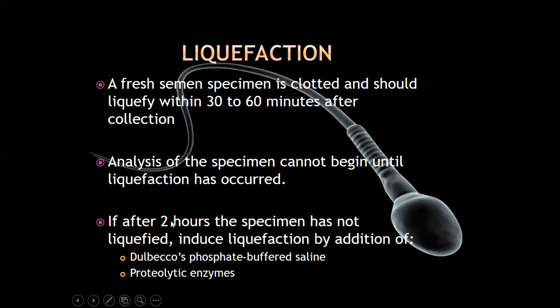Now, if after 2 hours the specimen has not liquefied, you need to induce liquefaction using Dulbecco's phosphate buffered saline and proteolytic enzymes such as bromelain. This is found in your notes, so please go over the entire procedure. What I want to point out here is that if you have induced liquefaction, you need to note in the result sheet which particular chemical method you used.